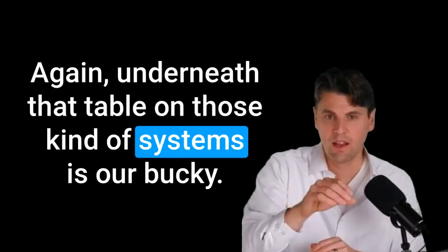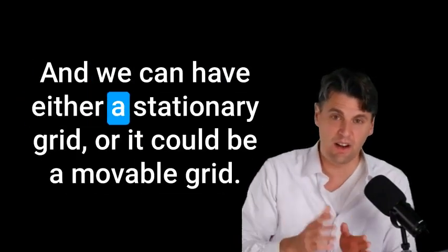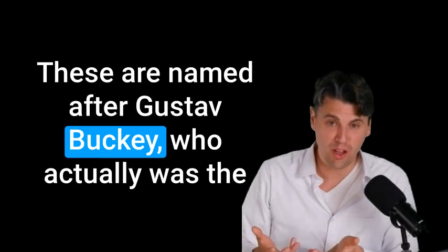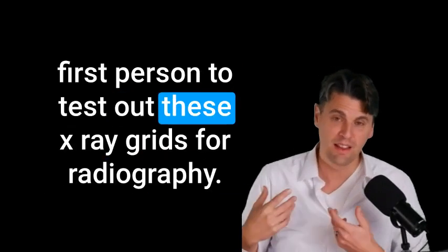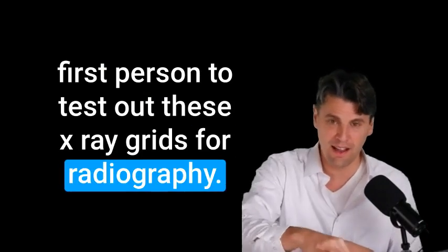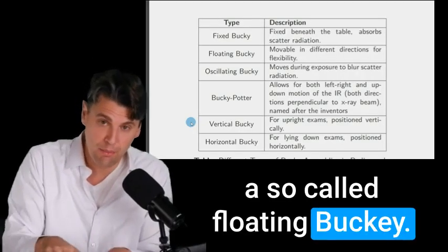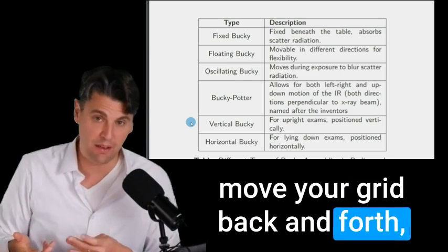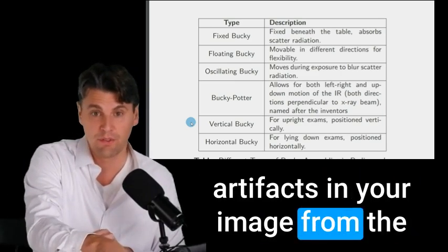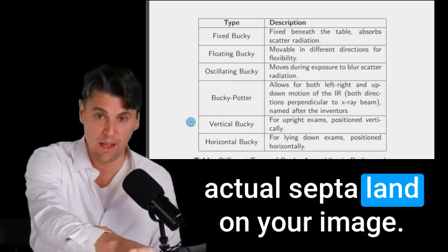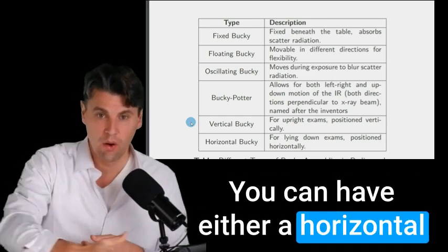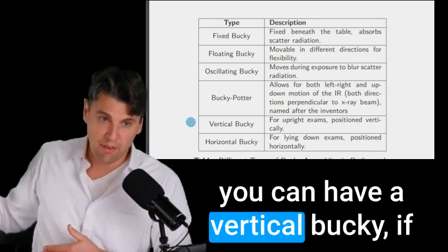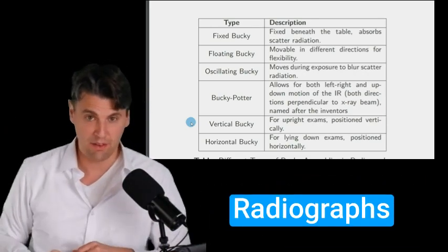Underneath that table on those of systems is our Bucky. And we can have either a stationary grid or it could be a movable grid. These are named after Gustav Bucky, who actually was the first person to test out these x-ray grids for radiography. You can have a fixed Bucky, a so-called floating Bucky, which you can move around, an oscillating Bucky, which is going to move your grid back and forth such that you don't have any artifacts in your image from the actual grid lines from where those actual septa land on your image. You can have either a horizontal Bucky if it's built into a table, we often call that a table Bucky, or you can have a vertical Bucky if you're going to be doing standing radiographs.